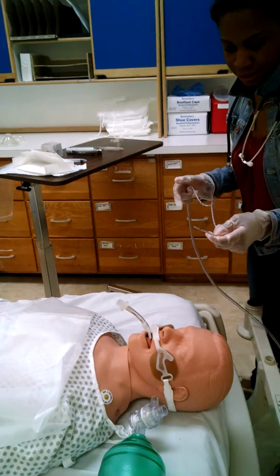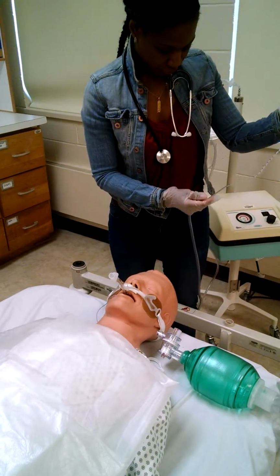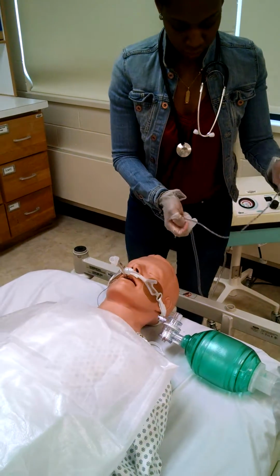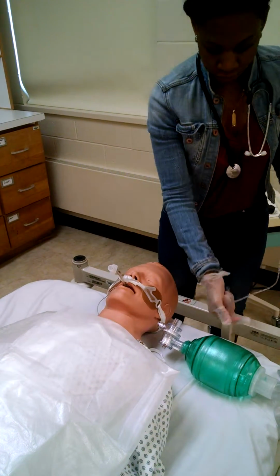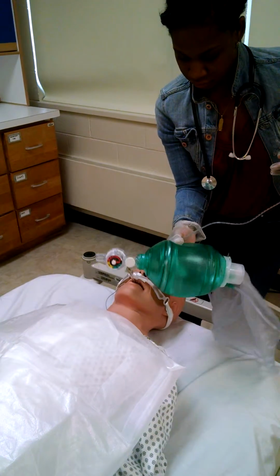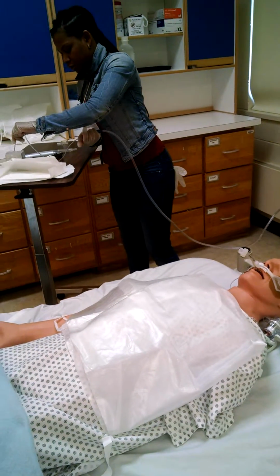I'm going to hyperoxygenate once again. And clean my suction catheter.